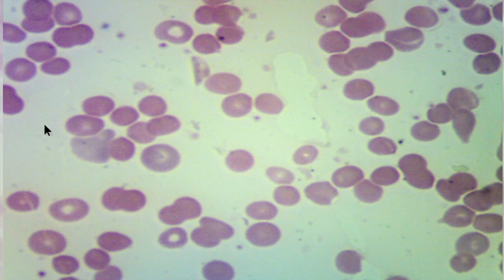And polychromasia indicates the attempt by the bone marrow to compensate for low RBC count in the blood.